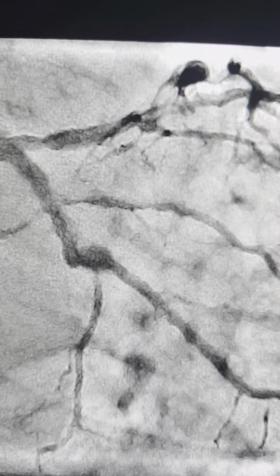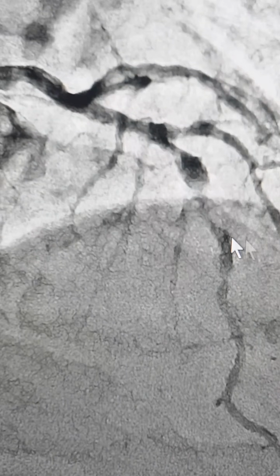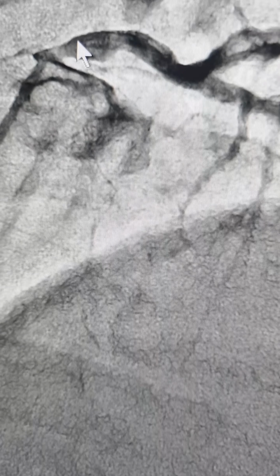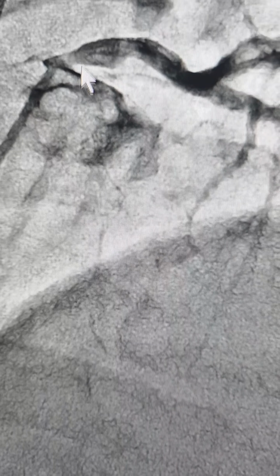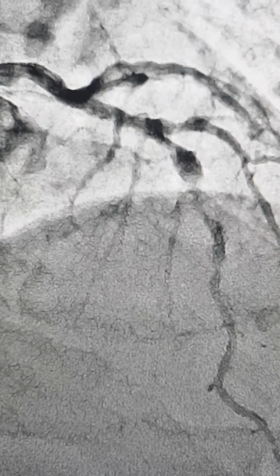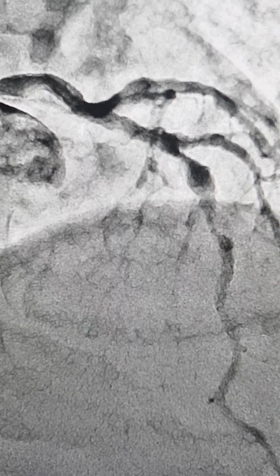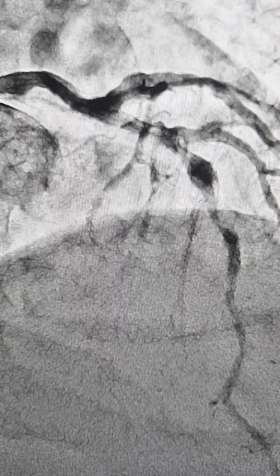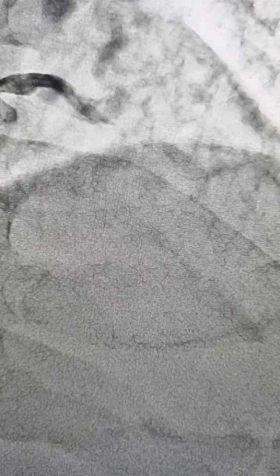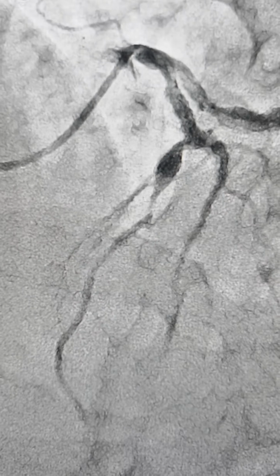The circumflex had ectasia, a little bit of dilatation, but the LAD had a severe narrowing here, post this little bit of aneurysm and little bit of narrowing. The diagonals were fine, and the distal LAD was okay. On this view, the left main didn't look much, but maybe this was around 50%. We reported it as 30 to 40, keeping this dimension in view. The LAD here again was not severe, and in the diastolic frame we didn't think that this was severe. But this LAD part was severe, and we looked at it in another view, and in this view it did look quite severe.